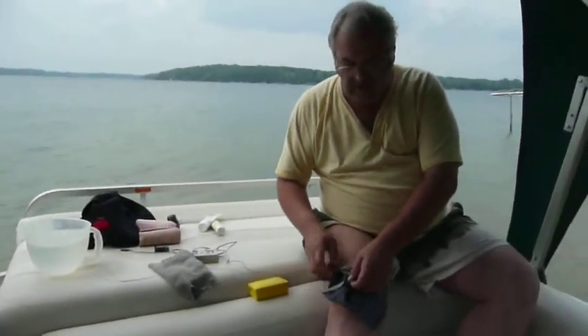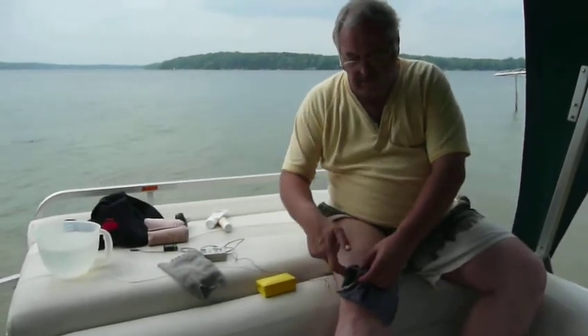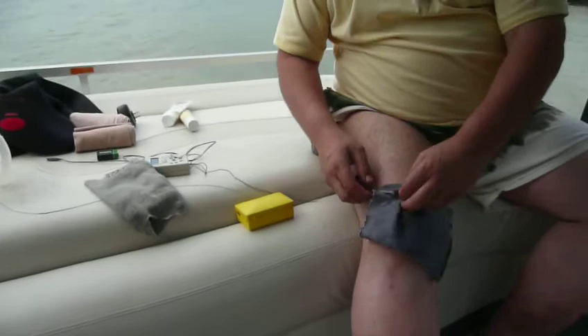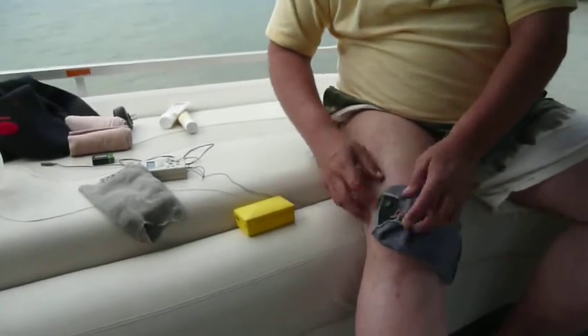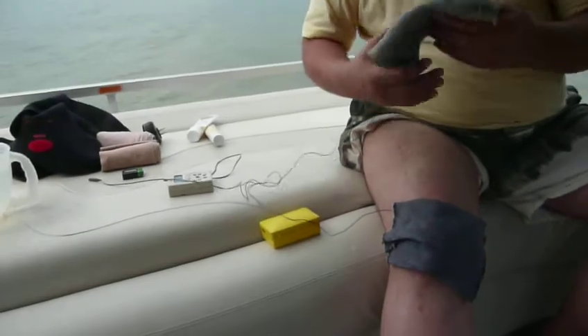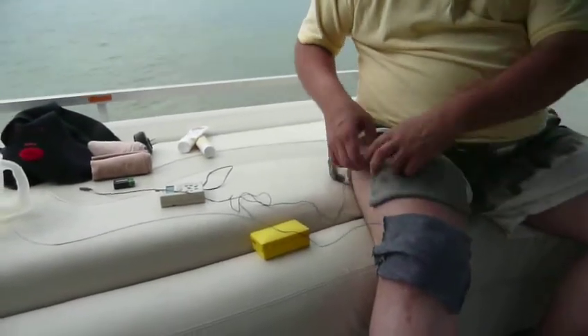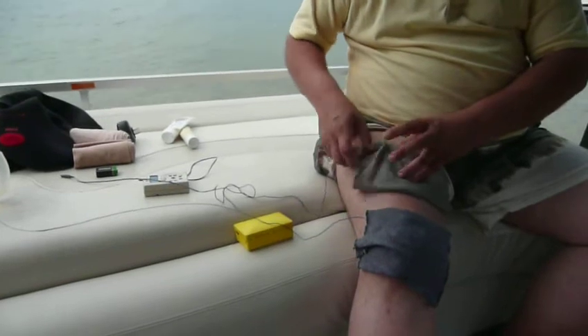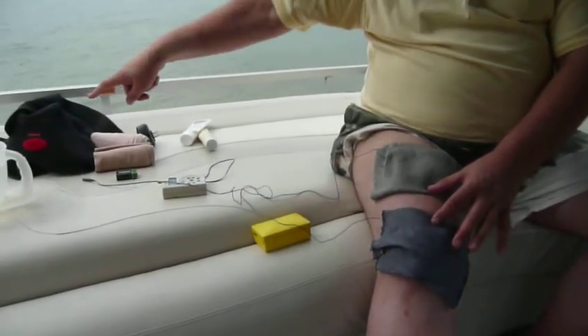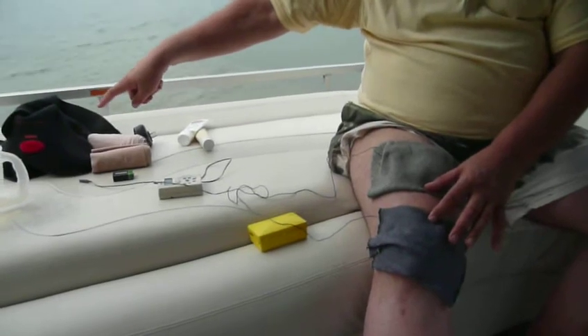You always make sure that — here's the right leg — the clip is up on the outside like that. For the thigh pad, dip it in the water and place it like so. Here's that clip. The spacing I came up with by how they landed on that unit from Bionicare.